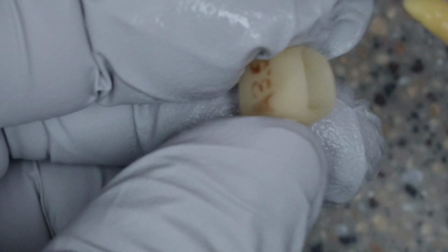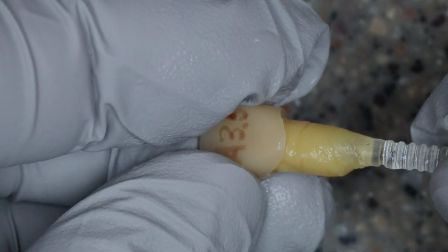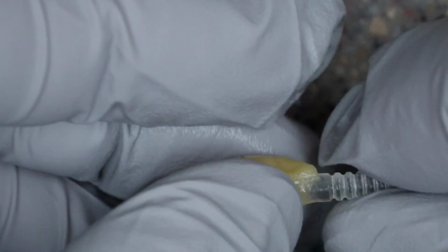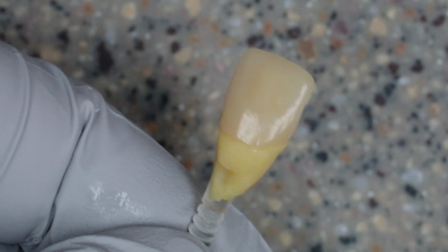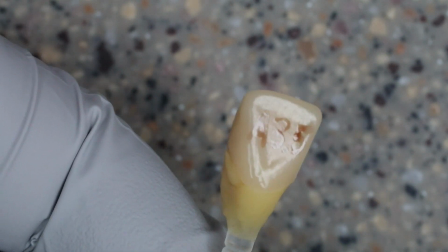Got the crown here, and we're just going to slide that in just like so. And we're going to shape it around the crown. We're just creating a custom die. This is a little wet from using the water, so I'm just going to dry this off a little. I don't want it wet when I actually apply the glaze, so that's why we're doing that. All right, let's get the glaze ready.